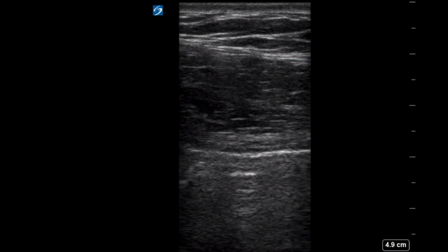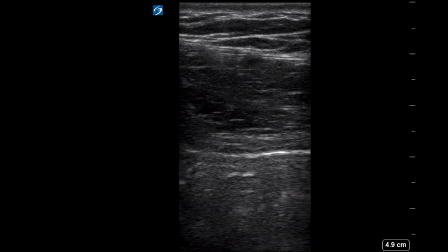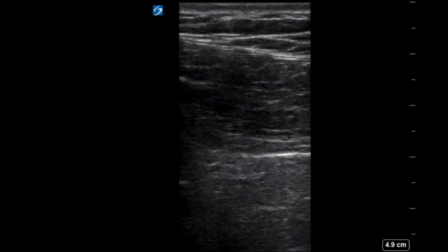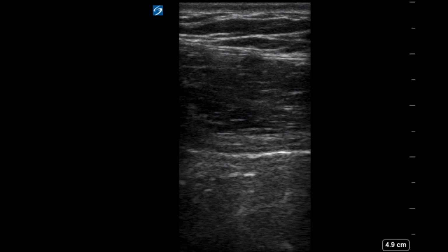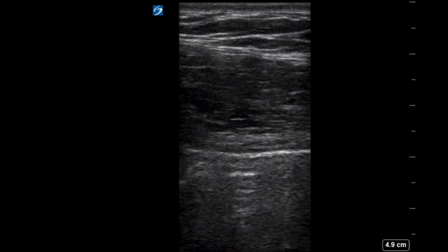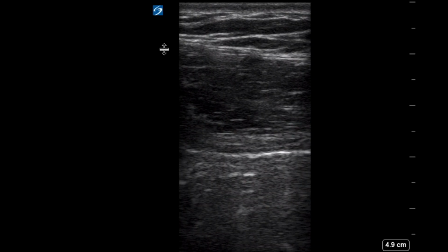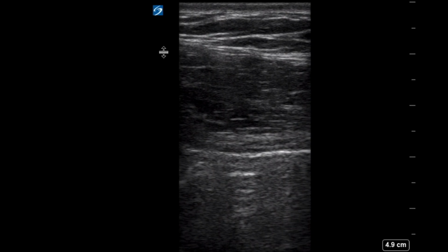What's the technique? Yeah, so we'll normally take the ultrasound probe. You can use the curvilinear or you can use the vascular, linear probe. So using the linear in this case, you can tell by the footprint up at the top, but either one will work.